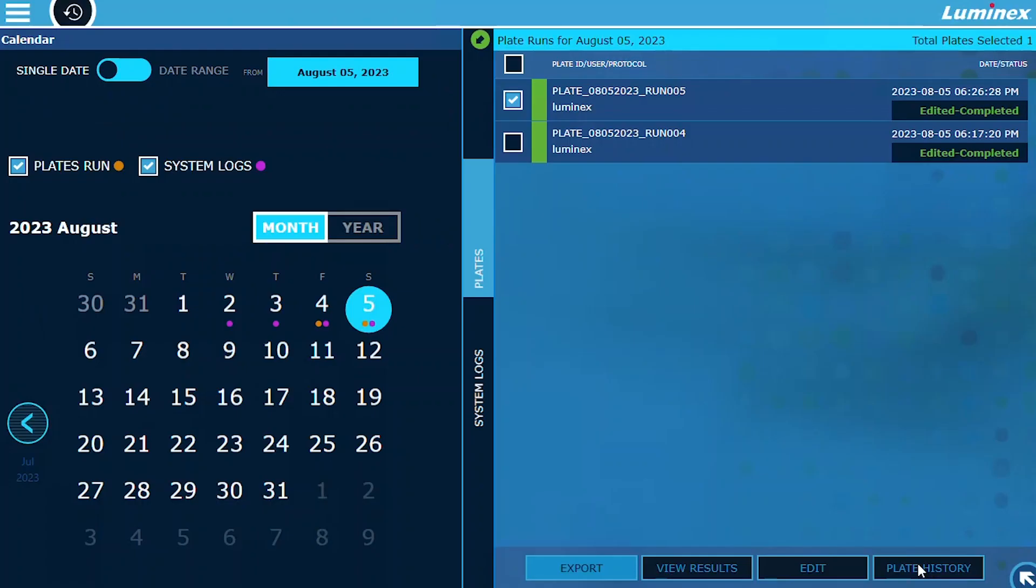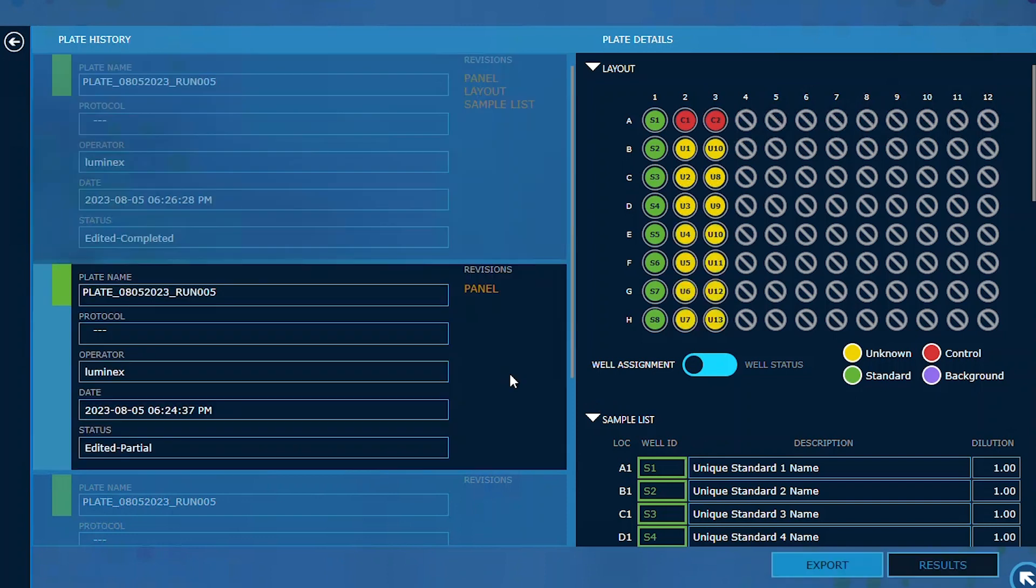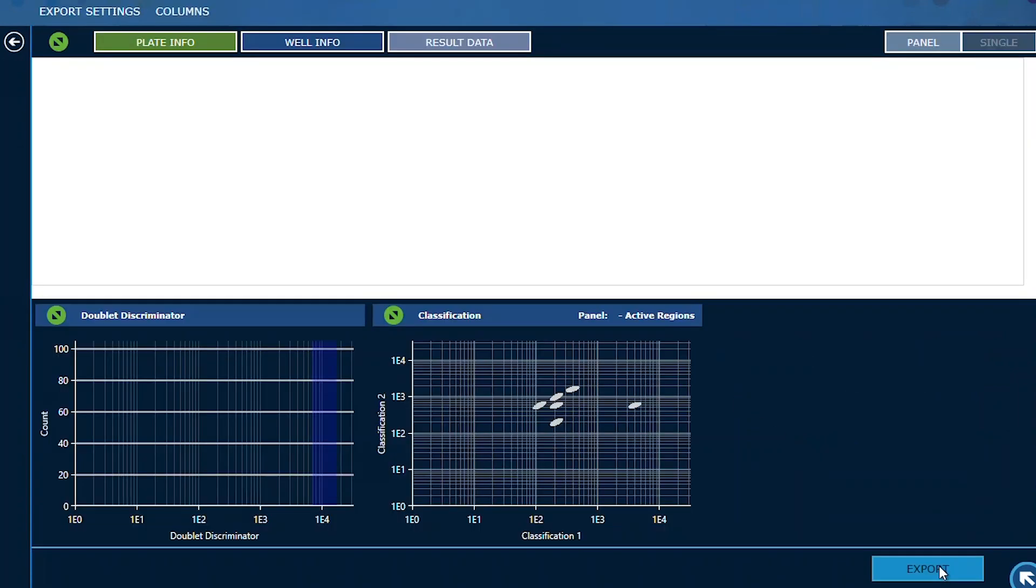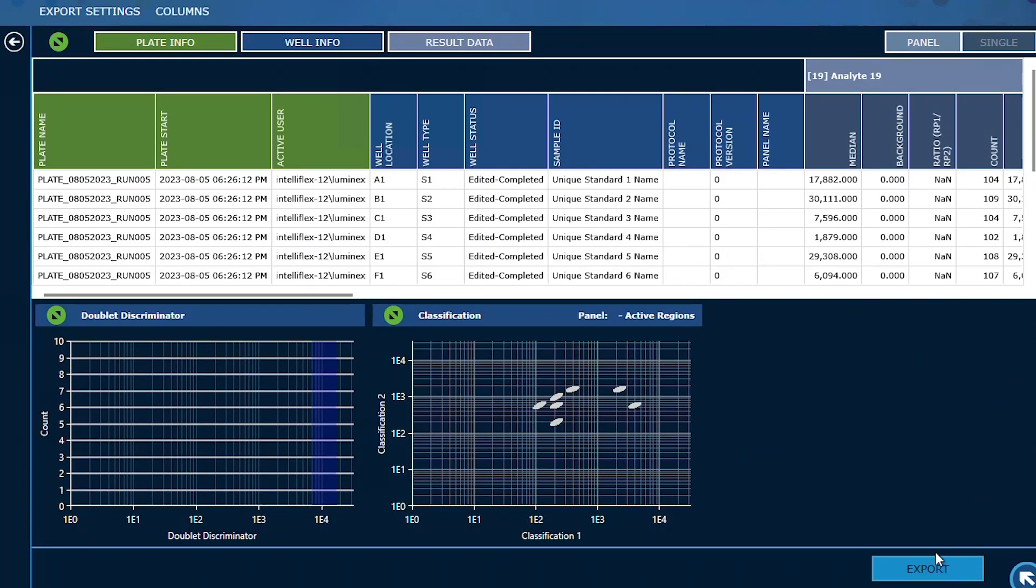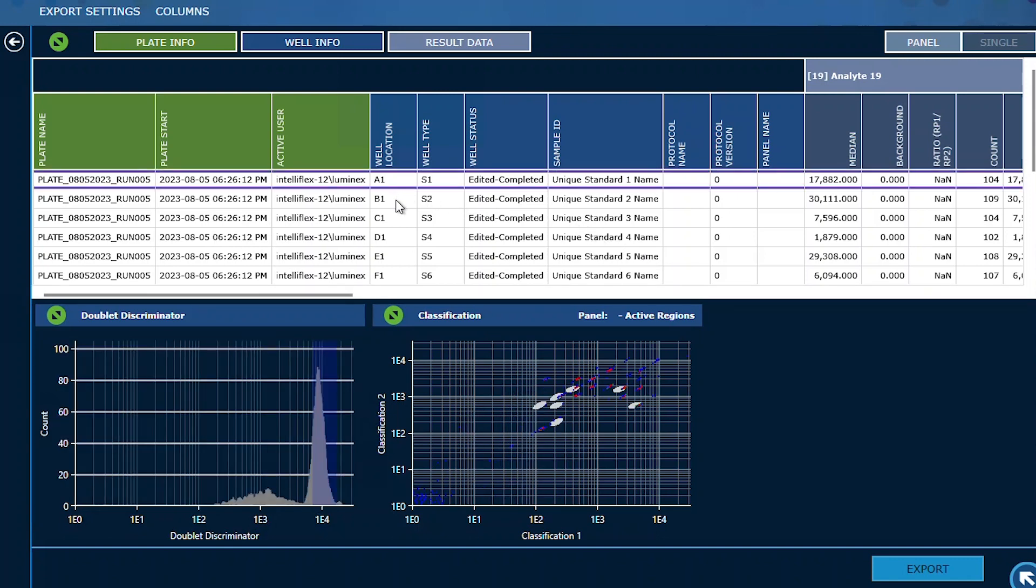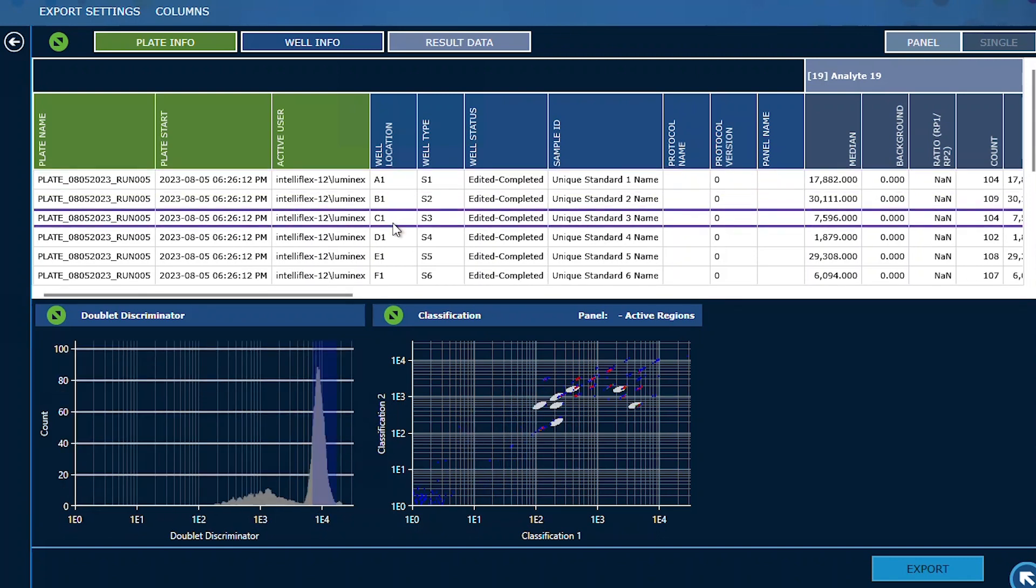Plate History. With Version 2.0, you have access to quickly view different versions of edited plates using Plate History. By clicking on Results, you can now view the doublet discriminator and bead map graphics for each well, providing you with valuable insights and visualizations.